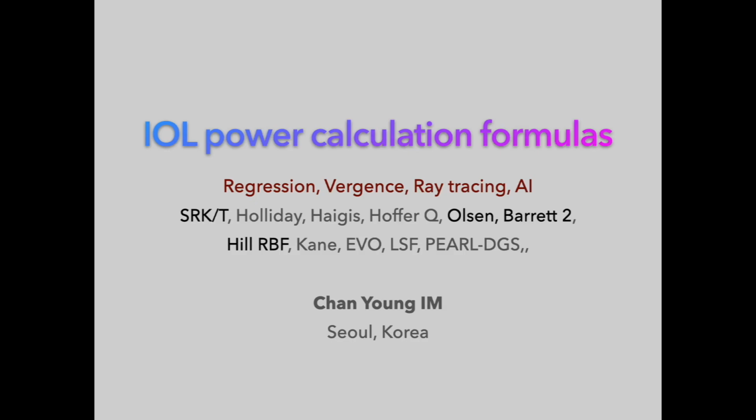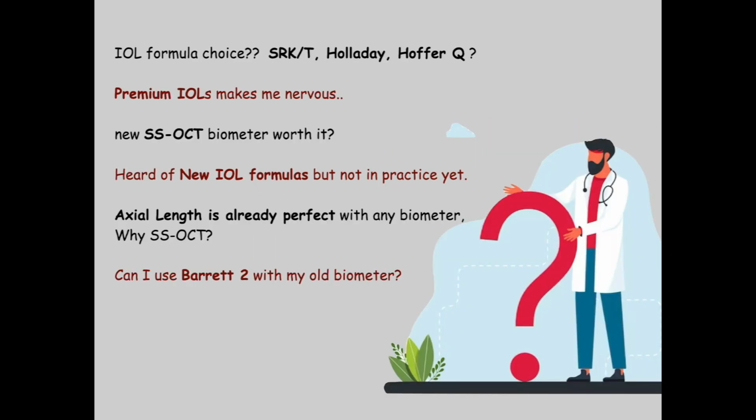Today, I'm here to talk to you about the developments in intraocular lens calculations and their impact on refractive accuracy after cataract surgery. For the last 30 years, cataract surgeons relied on SRK/T, Holladay, and Hoffer Q. The precision demanded by premium IOLs is a quarter diopter, plus or minus 0.25. A swept source OCT biometer is not a necessity for using newer formulas.